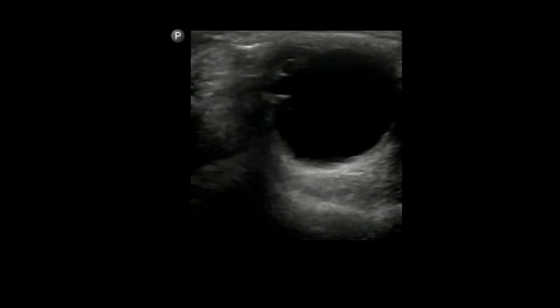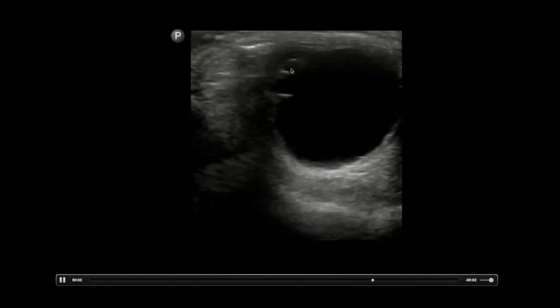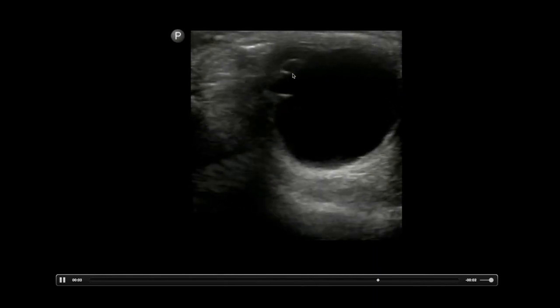The other thing you can do is check someone's pupillary reflex. So if you can't get access to their pupil, you want to at least see if their pupil's working. What you would do is shine a light in their contralateral eye while imaging their iris and pupil and making sure it constricts. So this person clearly has an intact pupillary reflex. This is a scan that I did, not as clear, but I'd say this is more typical. You can see that as you're shining light in the contralateral eye right by the pointer, the pupil clearly constricts there, and so this pupil is also working.